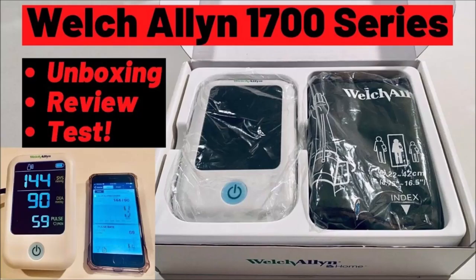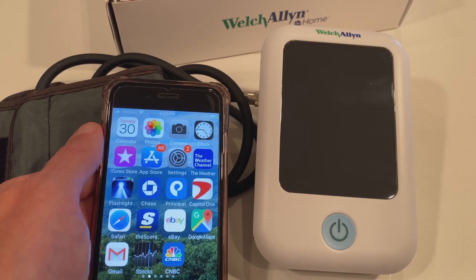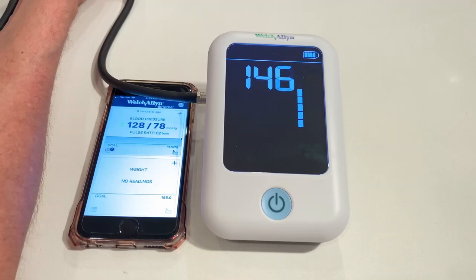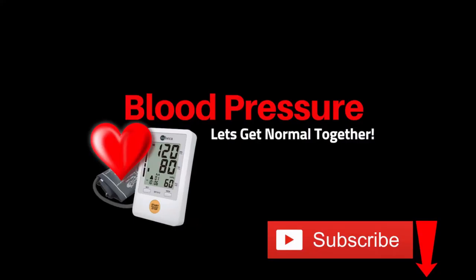In this video, I'm going to unbox a brand new Welch Allen home blood pressure monitor. I'll show you the features, how to set it up, and we'll take a blood pressure test to show you how it works.